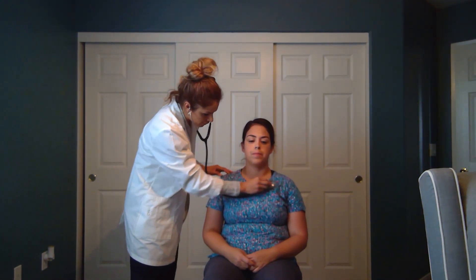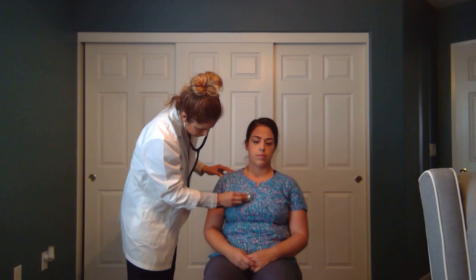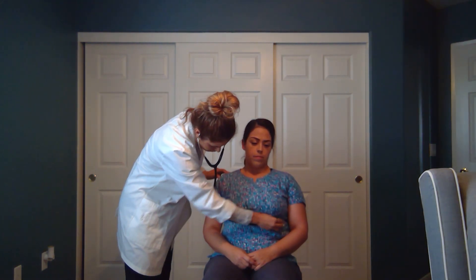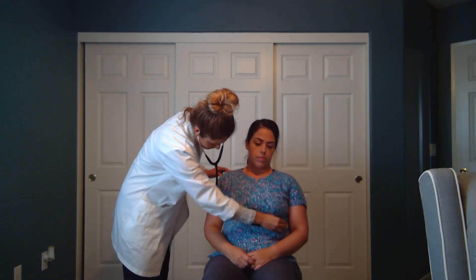Now we're going to move on to auscultation. We're going to auscultate the anterior portion and then move on to the posterior portion of the exam. I'm going to ask you to take a deep breath. If you feel shortness of breath at any time, just let me know and we can go at your pace.